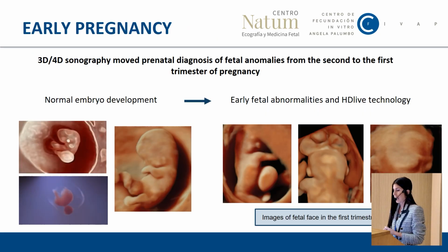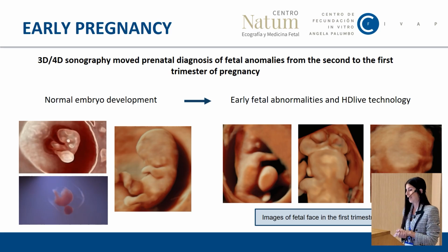In early pregnancy and the first trimester, it's also important, these 3D and 4D scans have moved prenatal diagnosis of fetal anomalies from the second to the first trimester of pregnancy. Making the diagnosis of fetal anomaly in early pregnancy will have a great impact on patient care.